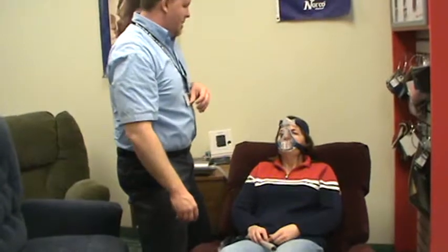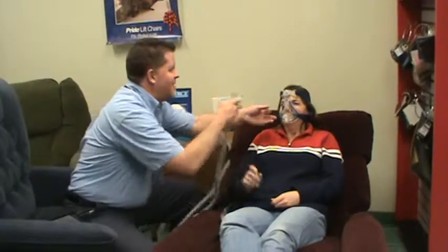Are you comfortable? Thumbs up or thumbs down? I'm going to start the machine — go ahead and lay your head back after I connect the holes.